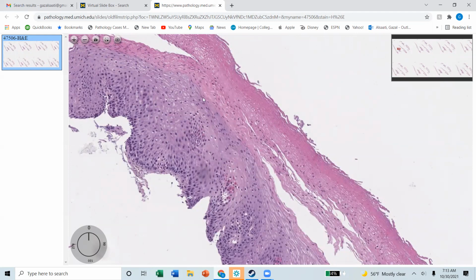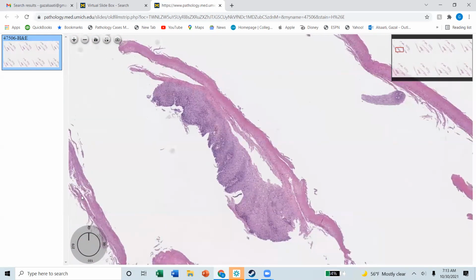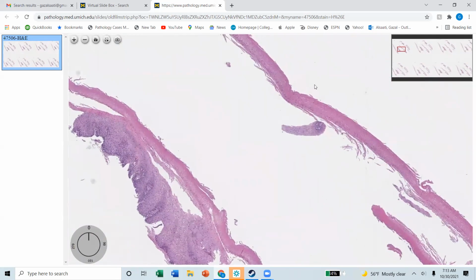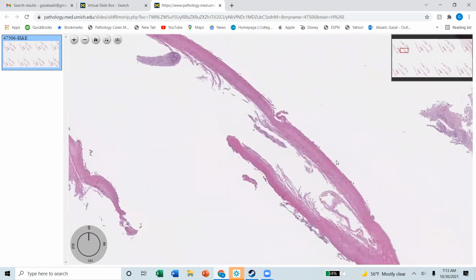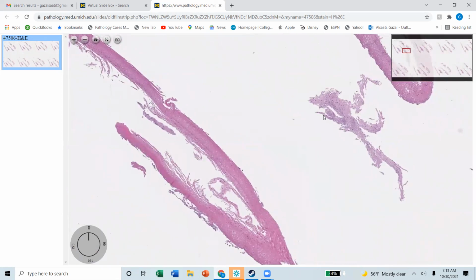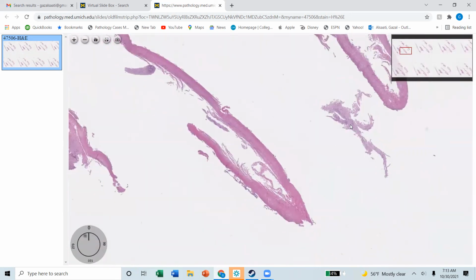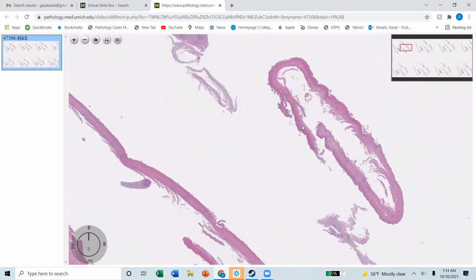You don't have to describe anything in your comment. You don't have to do anything. You'll say fragments of esophageal mucosa with friable surface, most consistent with sloughing esophagitis. If the doctor calls this normal, completely normal, you will be descriptive and say, no fungal organisms seen. Correlation with clinical history is recommended to rule out esophagitis dissecans or sloughing esophagitis.